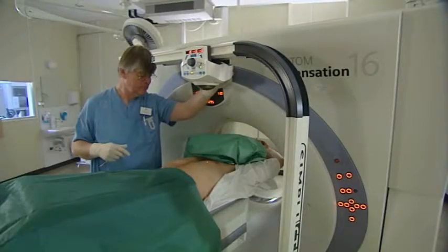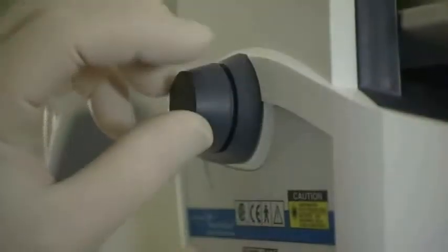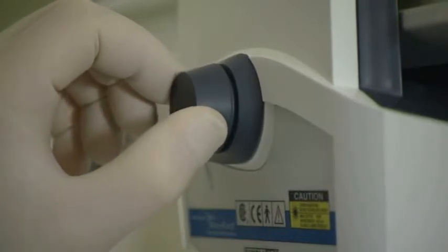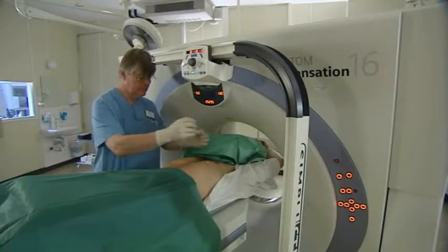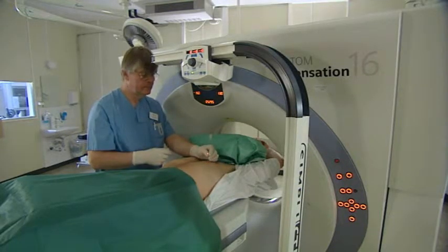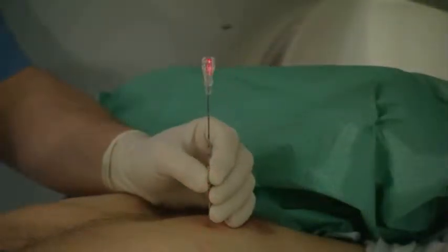Move the laser unit so that the laser dot is directly at the entry point by using the fine-tuning mechanism. The procedure of placing the needle in line with the laser is the same as with a simple angulation. Hence, SimpliCT is making it much easier to do double angulated procedures.